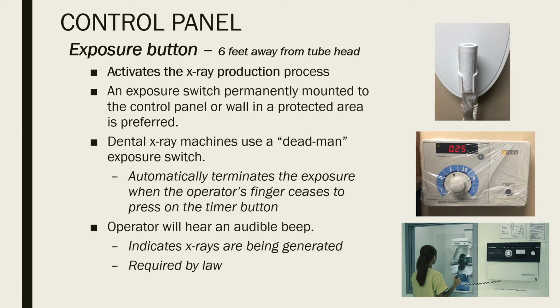Also, all machines have what we call a dead man switch. So when we say dead man switch, once you press the exposure button and then you release it, it will automatically end the exposure. So even if you're not done with your exposure, it will automatically stop, and that's called the dead man switch.